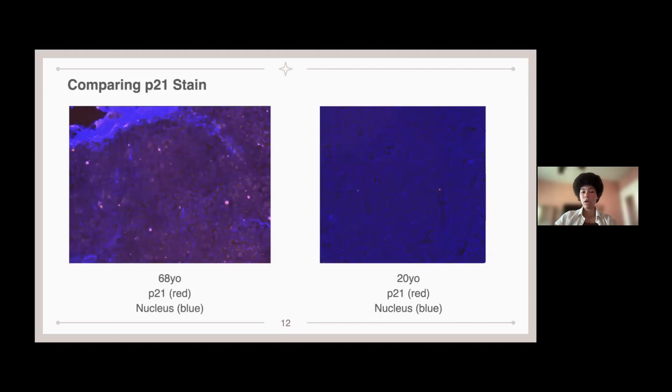And that is also concurrent with the P21 stain, where there are a lot more red dots exhibited in the 68-year-old stain compared to the 20-year-old stain, indicating an increase in P21 with aging.